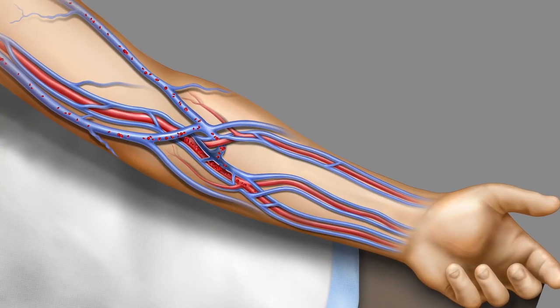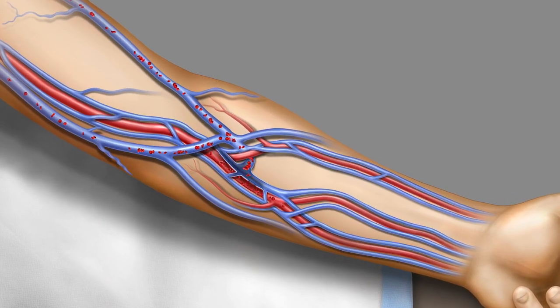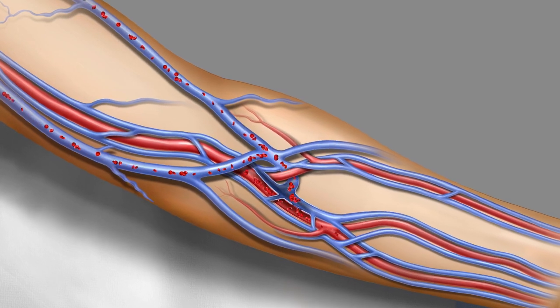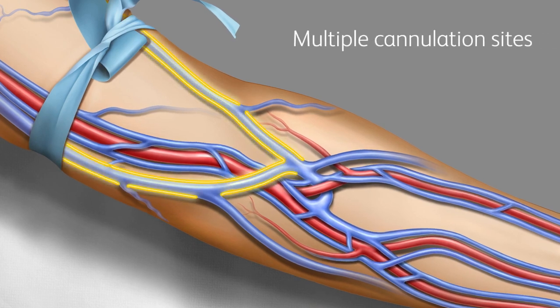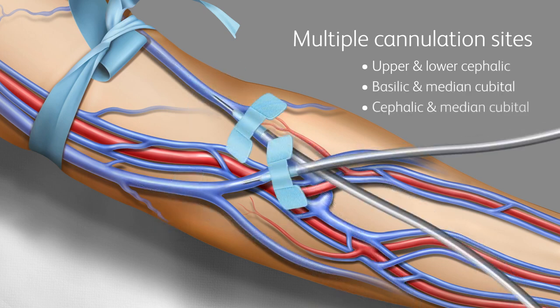Lastly, when a patient has more than one brachial vein, and one of those is observed to have significant outflow, we recommend embolizing that brachial vein to promote blood flow to the superficial vessels. Over the next several weeks, the EndoAVF will mature. Due to the nature of the anatomy, multiple outflow vessels may dilate. Keep this in mind when assessing the EndoAVF for cannulation.